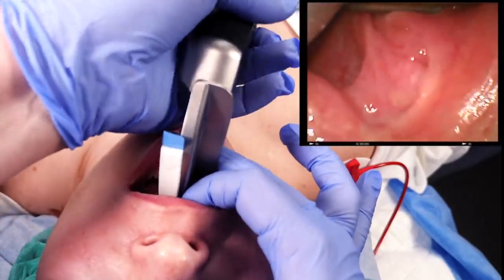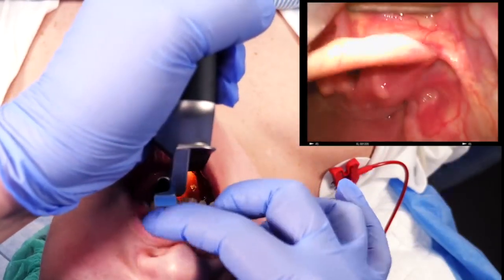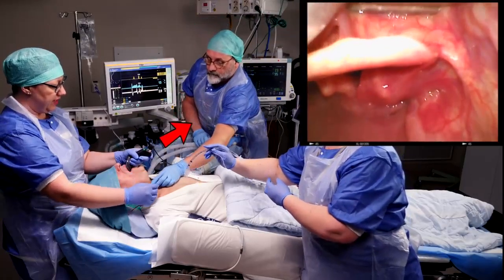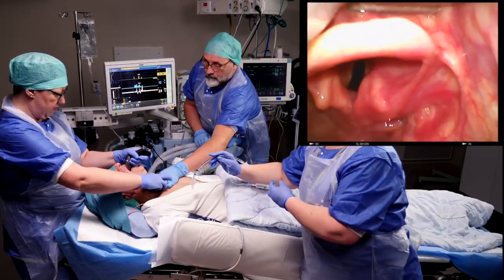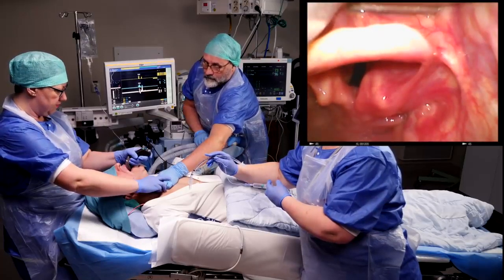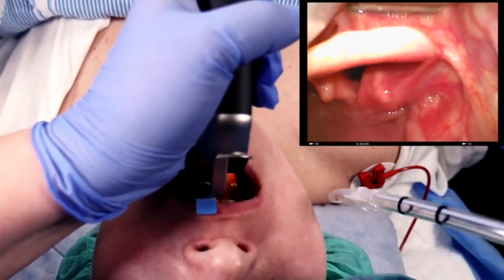Advance the blade until you see the epiglottis and place the tip in the vallecula, the recess at the base of the tongue. At this point, you can start to apply some force in the direction of the laryngoscope shaft. Sometimes a light external force on the larynx can make the vocal cords spring into view. Ask for your assistant's hand and move it to apply backwards, upwards, rightward pressure, or BURP for short. Make sure you don't pinch the lips and do not exert any pressure on the front incisors.